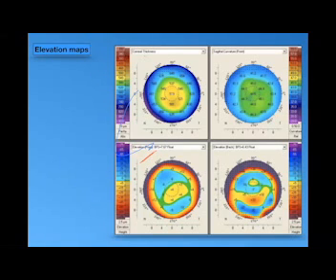Going back to the same question of Dr. Ihab Tharwat, normally the commonly used is the best fit sphere.